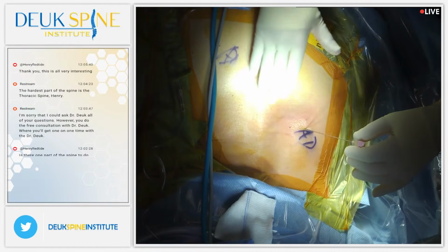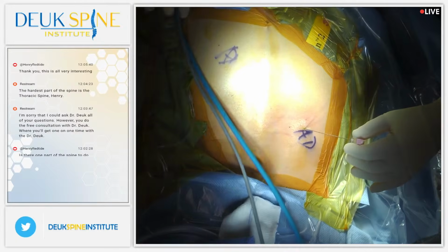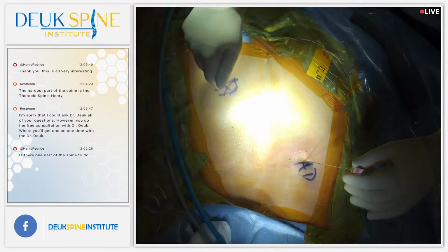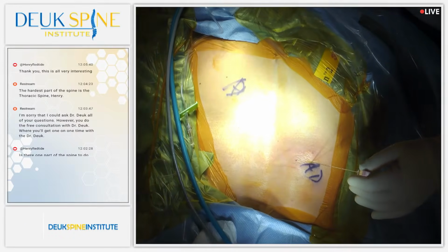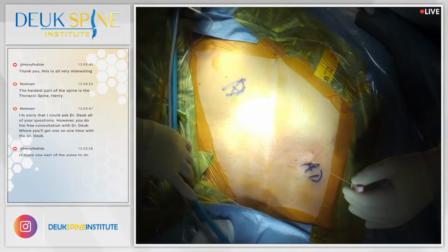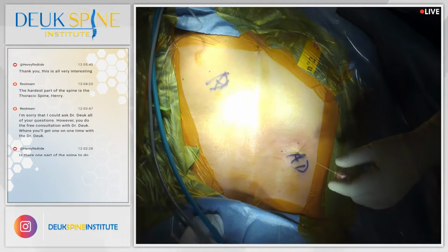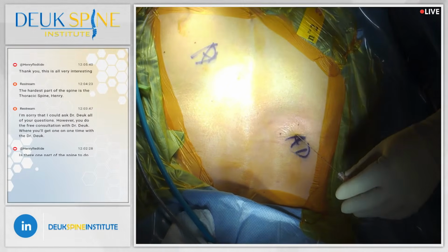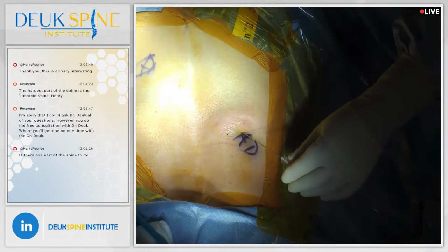Here, where the L4-5, L5-S1 disc injuries are. She has herniations. And she has severe pain right where that mark is, in her right buttock. That's going to be a piriformis problem. So we're going to fix both today. But the first thing we're going to do is fix the disc pain at L4-5, L5-S1 through a left approach.